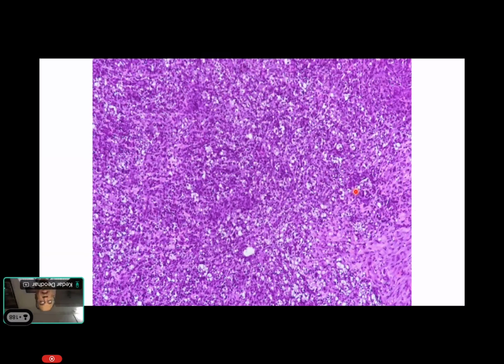This is actually one of the frozen section slides. This is completely chronic inflammation and macrophages. So this was chronic inflammation and xanthogranulomatous cholecystitis. It can look like a cancer. It can be very irregular in thickness, but this is where at least 2 sections are to be taken at frozen, and obviously many more sections to be taken for paraffin processing.